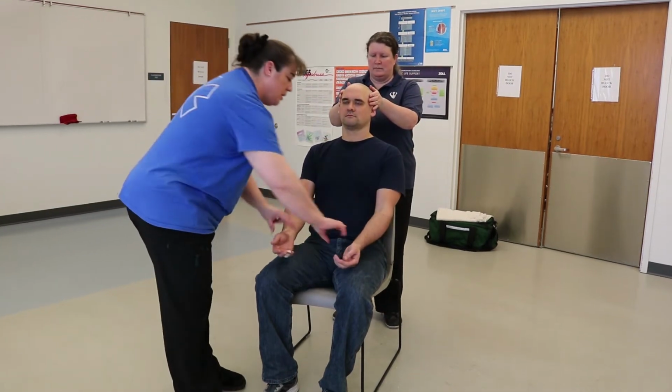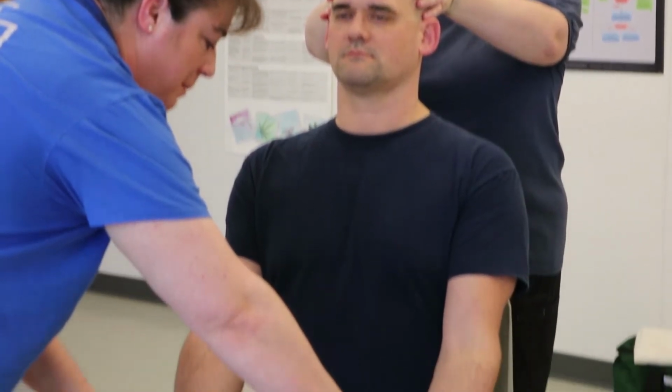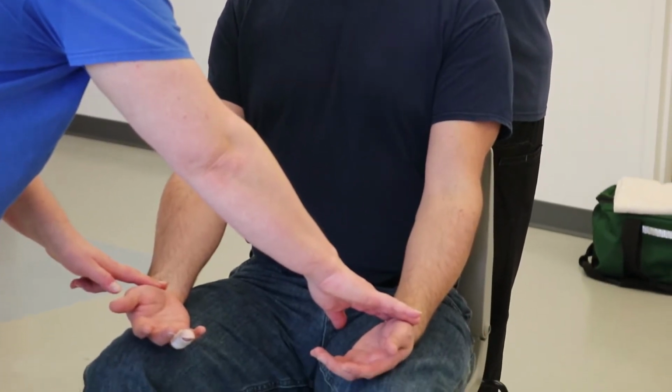I have no questions. You may begin. The scene is safe and I have on my PPE. I'm going to ask my assistant to please hold the patient's head in a neutral inline position and maintain it. I am then going to check PMS. I'm checking pulses bilateral and they are present and normal.